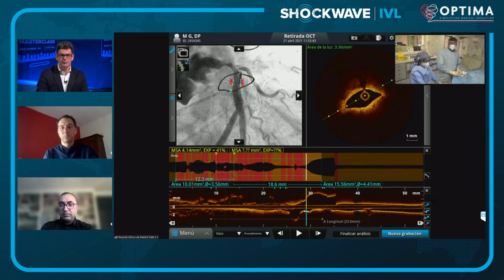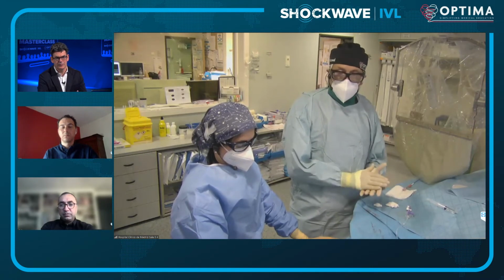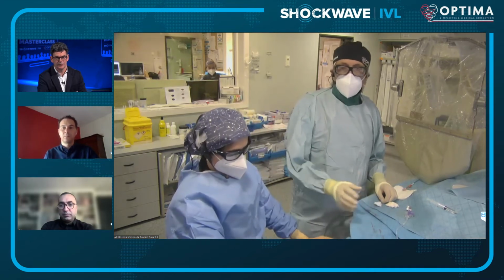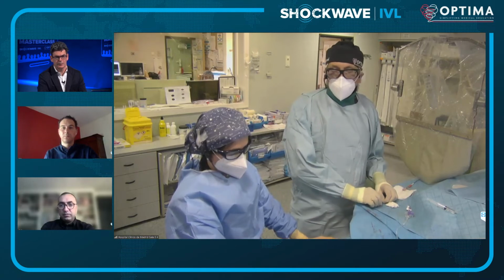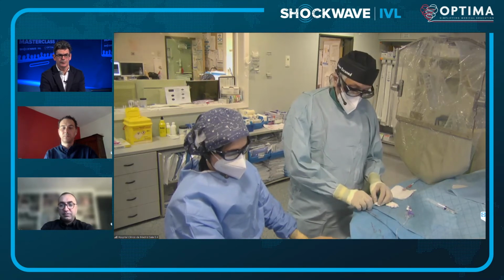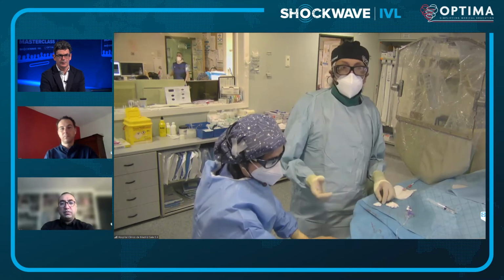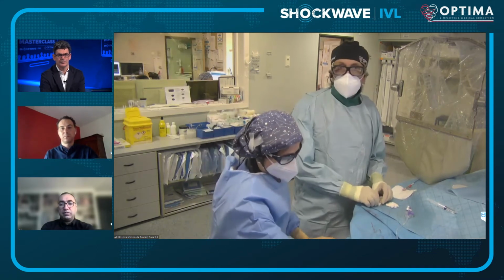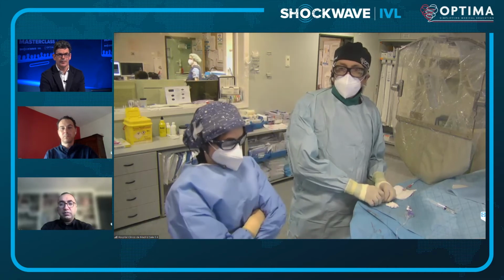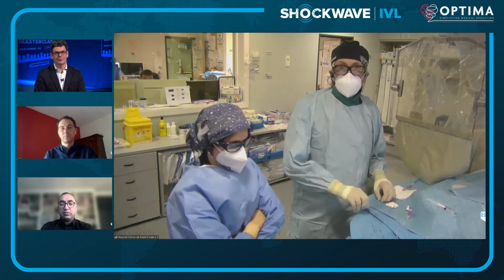And, you know, even as Azeem mentioned before, in some cases we have opted to perhaps perform a rotational atherectomy first, particularly in those cases where we anticipated a lot of problems advancing the device later, and subsequently lithotripsy. And probably there is a synergy in some cases, perhaps with nodular calcium. We are working on understanding if the pattern of calcification influences outcomes. Actually, Nieves is the PI, and I have the pleasure of being the co-PI of a study looking prospectively with OCT at the pattern of calcification and how this is influenced by shockwave. So we will have some information in the future.